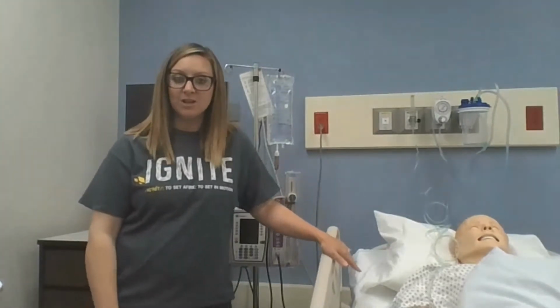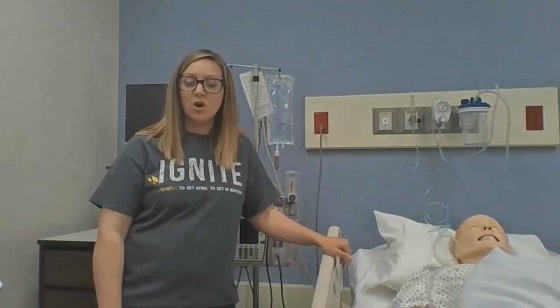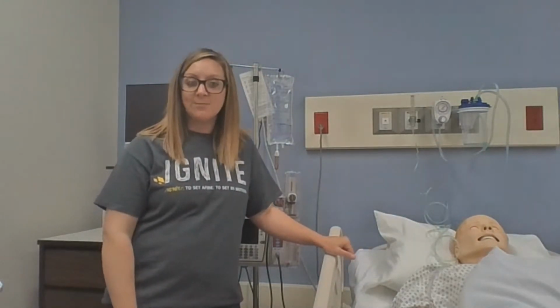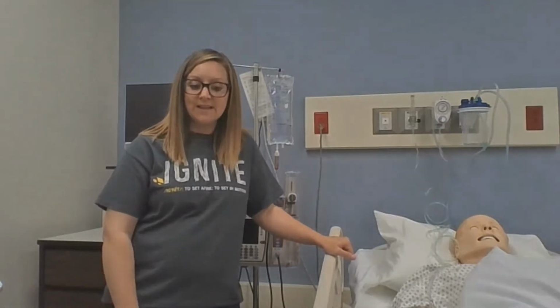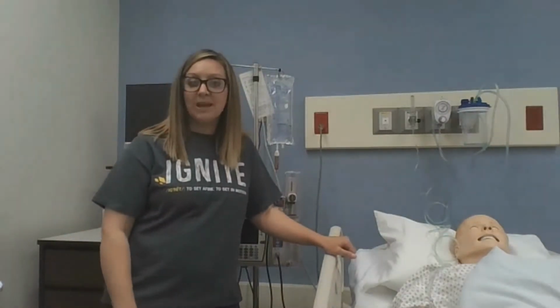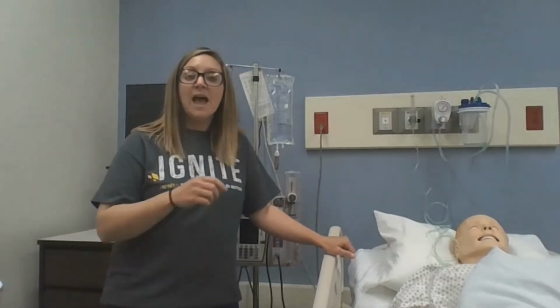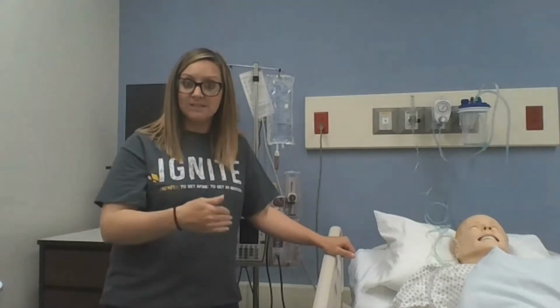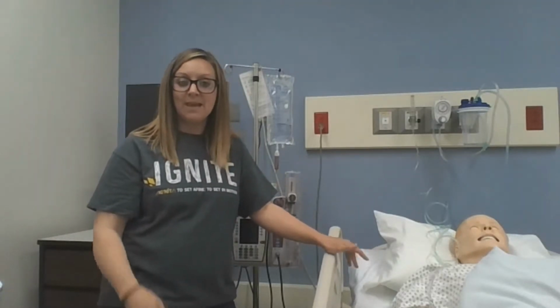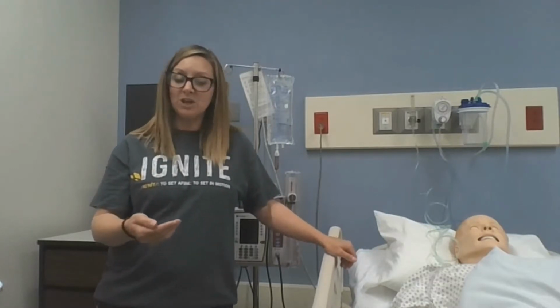PCA stands for patient-controlled analgesia. We use this to administer narcotics for pain management. It can be used for patients in end-of-life care as well. So sometimes if we're doing a continuous infusion of maybe fentanyl or something like that, we might do a continuous infusion through there. But beyond that, we would use it maybe in a post-operative patient that requires frequent pain medication.